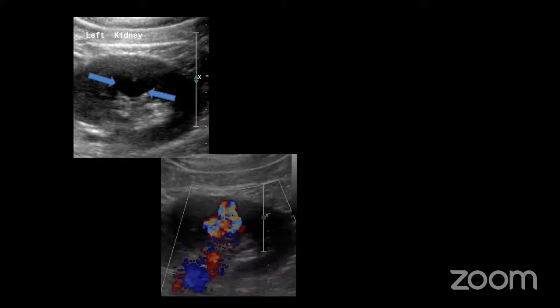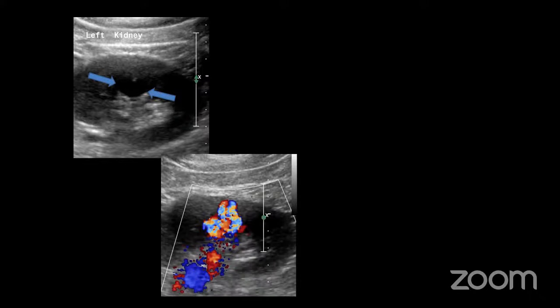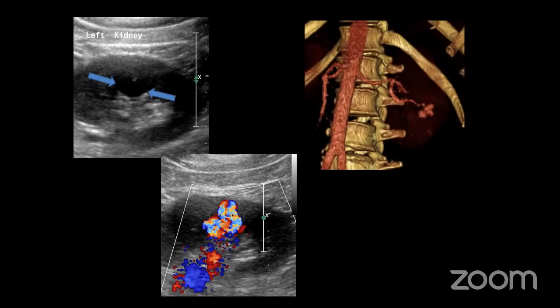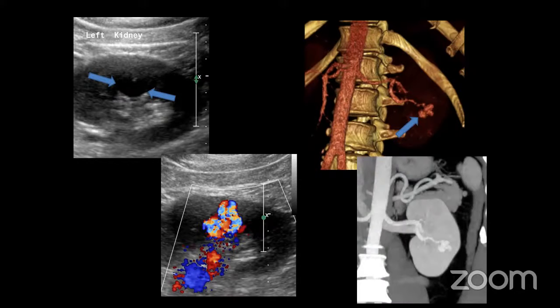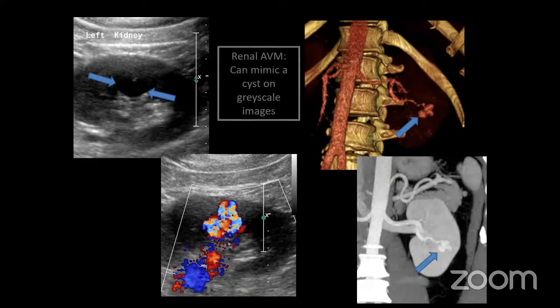Here's a lesion that looks like a simple cyst — anechoic with thin or imperceptible walls. But when we add color Doppler, we see all this turbulent flow, which is very concerning for an AVM. On CTA, you can see the left artery giving a branch to a lobular hypervascular structure in that region — a renal AVM. On a coronal MIP, there's the draining vein. Renal AVMs can mimic cysts on grayscale images, so it's key to add color Doppler.